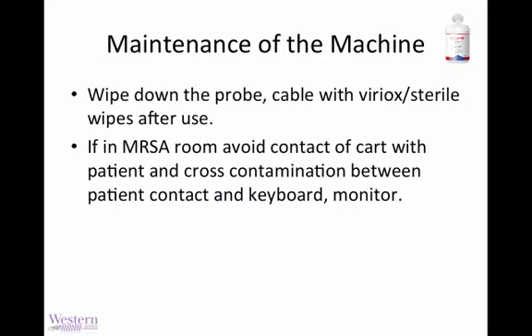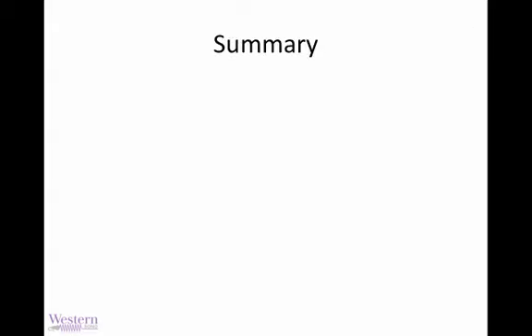Please remember to maintain the machine, especially when it comes to invasive procedures, and especially with the mortality rates that we know that central venous catheter infections can produce. So please, please, please clean the machines for the sake of your colleagues and your patients.